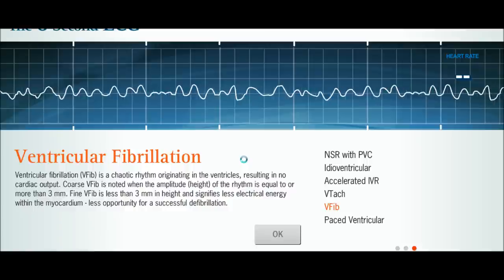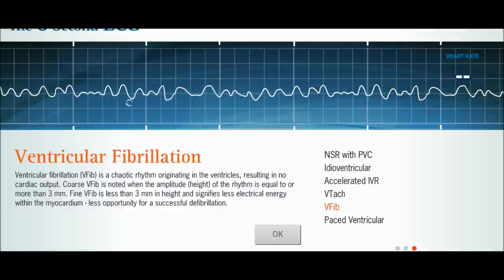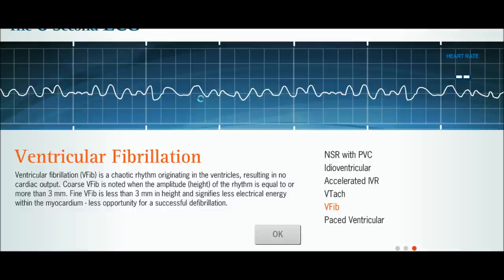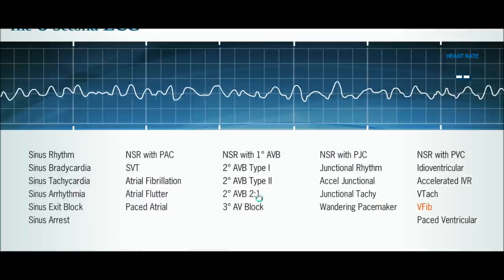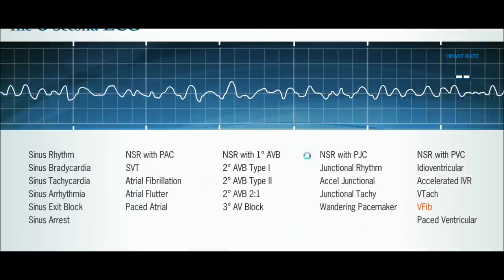This is also deadly — this is VFib, just random lines of electrical activity. The heart is essentially quivering like a bag of worms; there is no coordinated contraction and no cardiac output. This needs to be corrected with either successful defibrillation or other pharmacological treatments. Those are the main rhythms you should be familiar with.